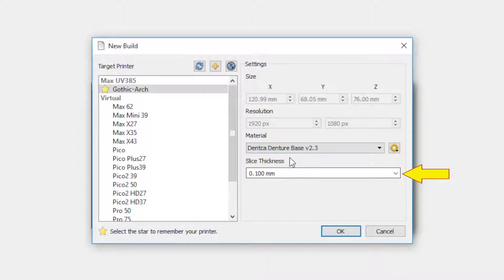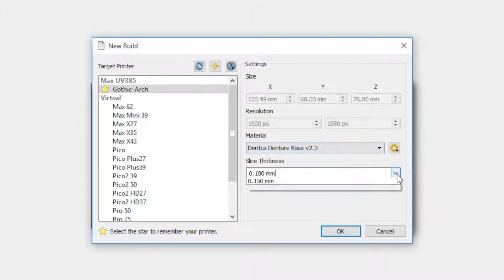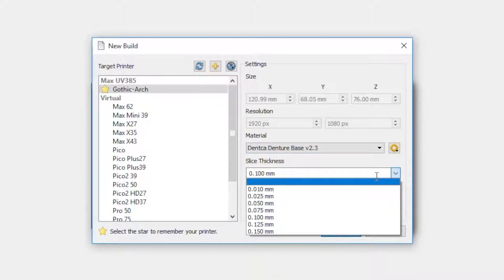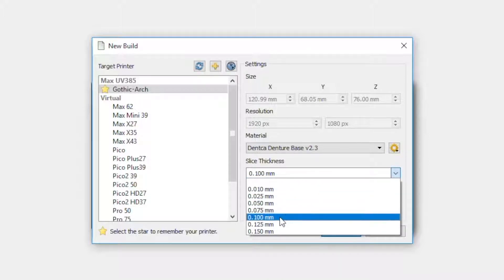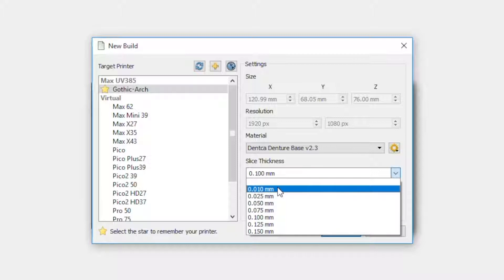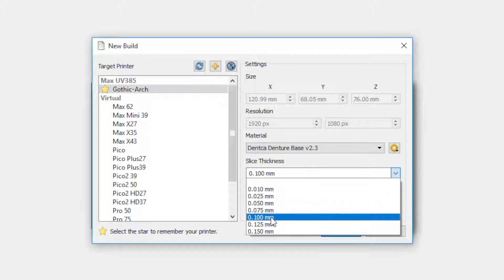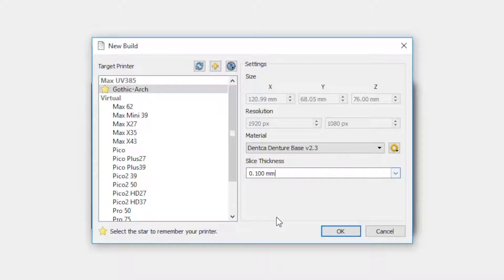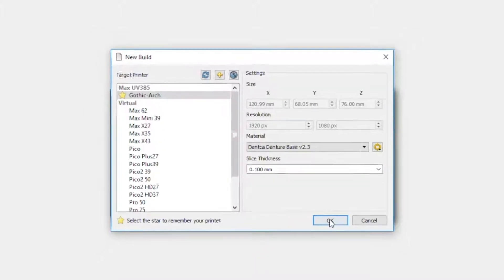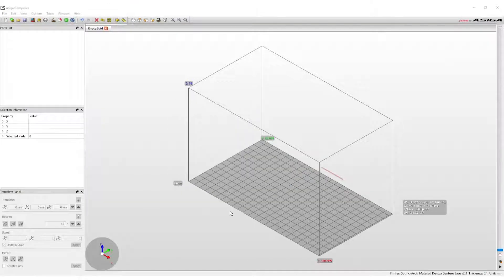The next drop-down menu will be the selection of the slice thickness desired for the print. The thinner the layer selected, the more high quality the print will be, but it will also take more time to print. Bases can be printed anywhere from 100 micron layers to 10 micron layers. For most base prints, 100 micron layers is the best option. It allows for a great finish to the denture in a shorter amount of time. Select OK to open up the build plate envelope, where the STL files will be imported to.